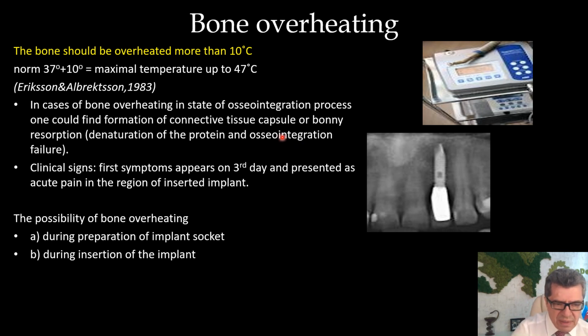Clinically, after 3 days after surgery, the outpatient can feel acute pain in the region of the inserted implant. Unfortunately, in the X-ray we cannot see it at the early stage. Only later we have fibrointegration or bone resorption, which we can check on the X-ray. But overheating can occur not only in the preparation of the implant socket but also during insertion of the implant into the bone.